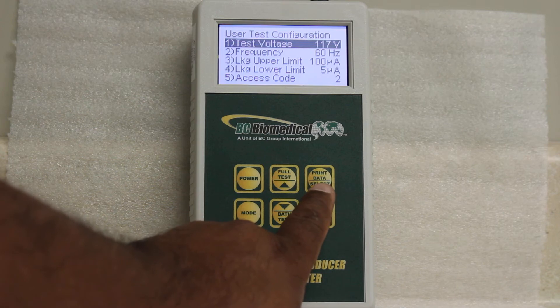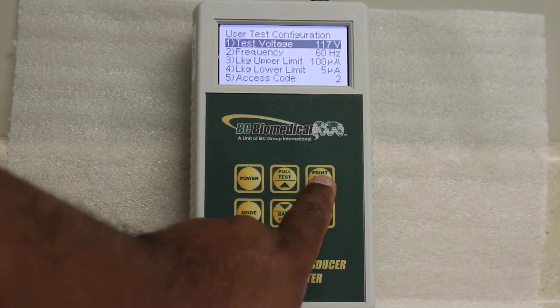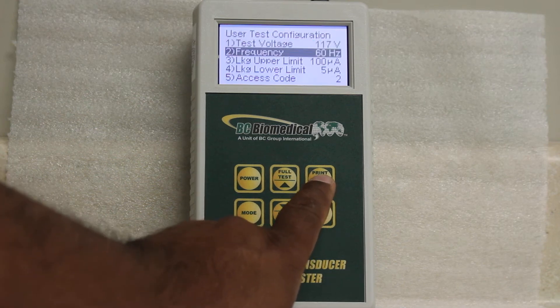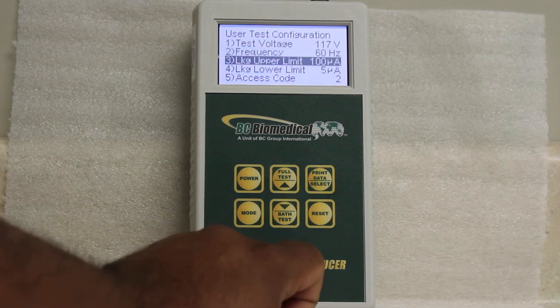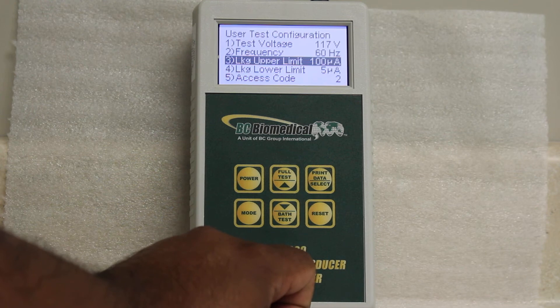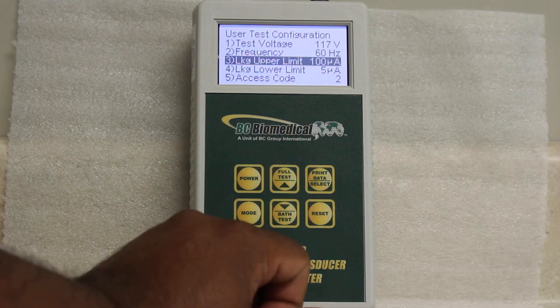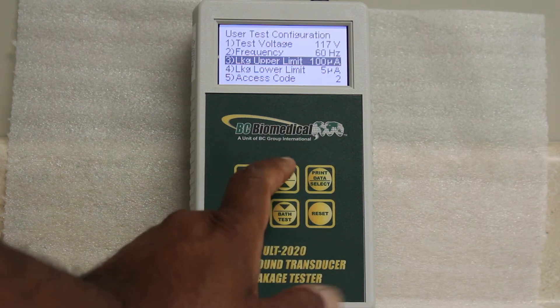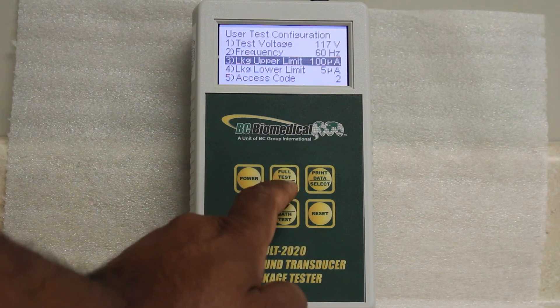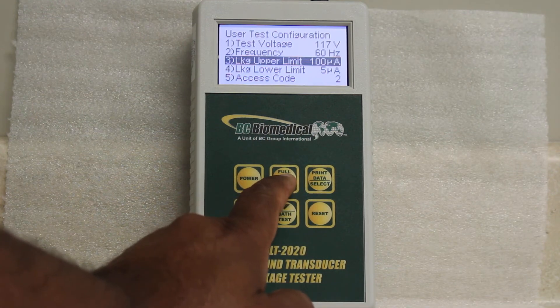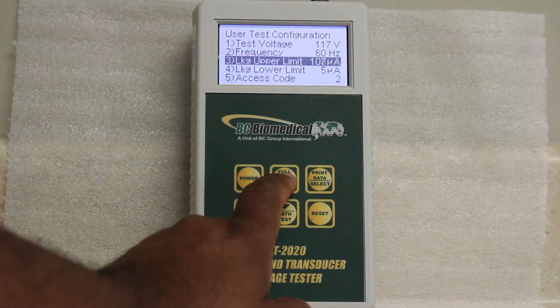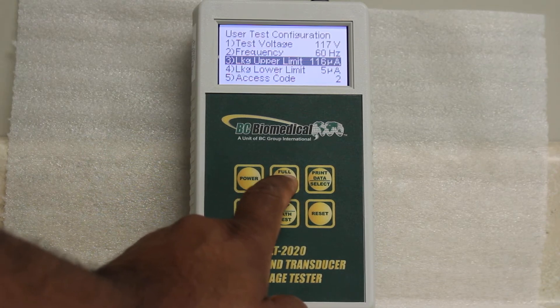You press the print data select button and navigate down to the leakage upper limit, and then you press the up arrow to start changing it from 100 to 185.